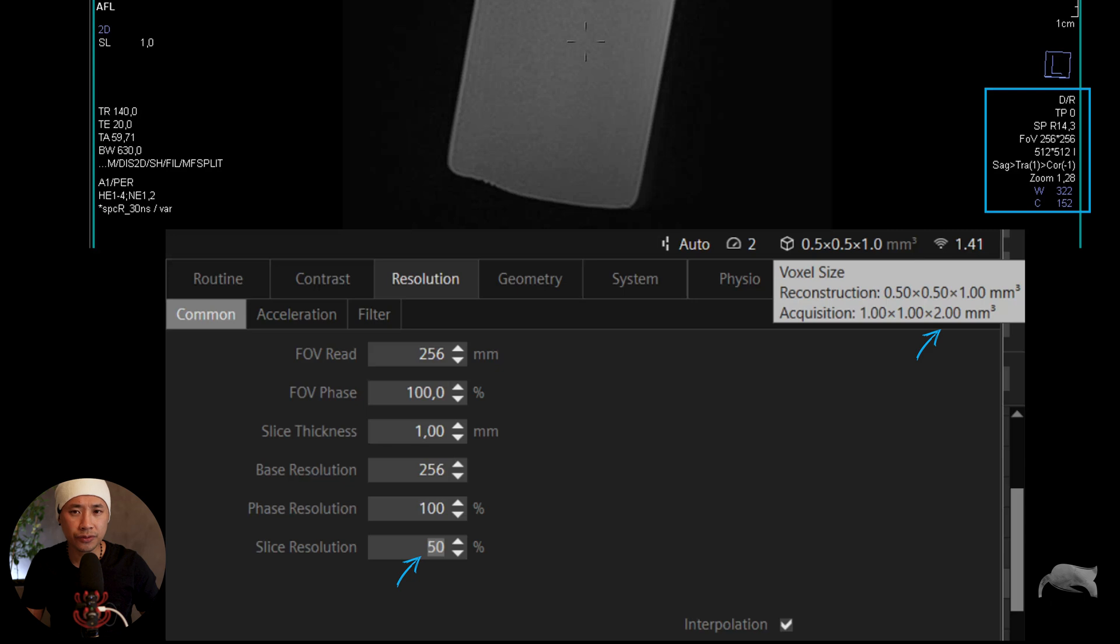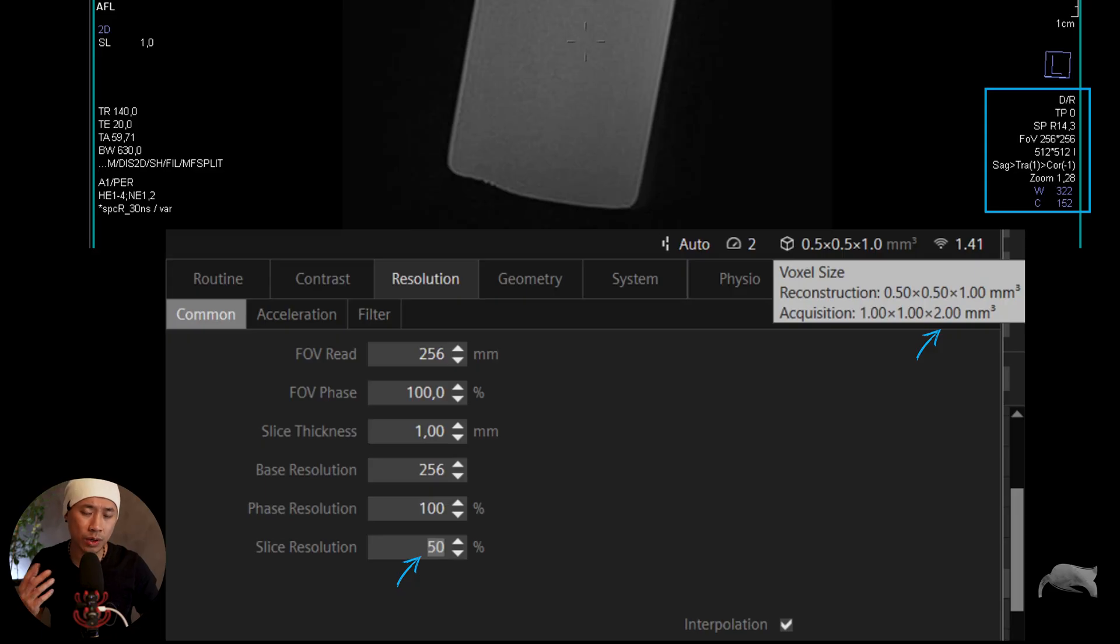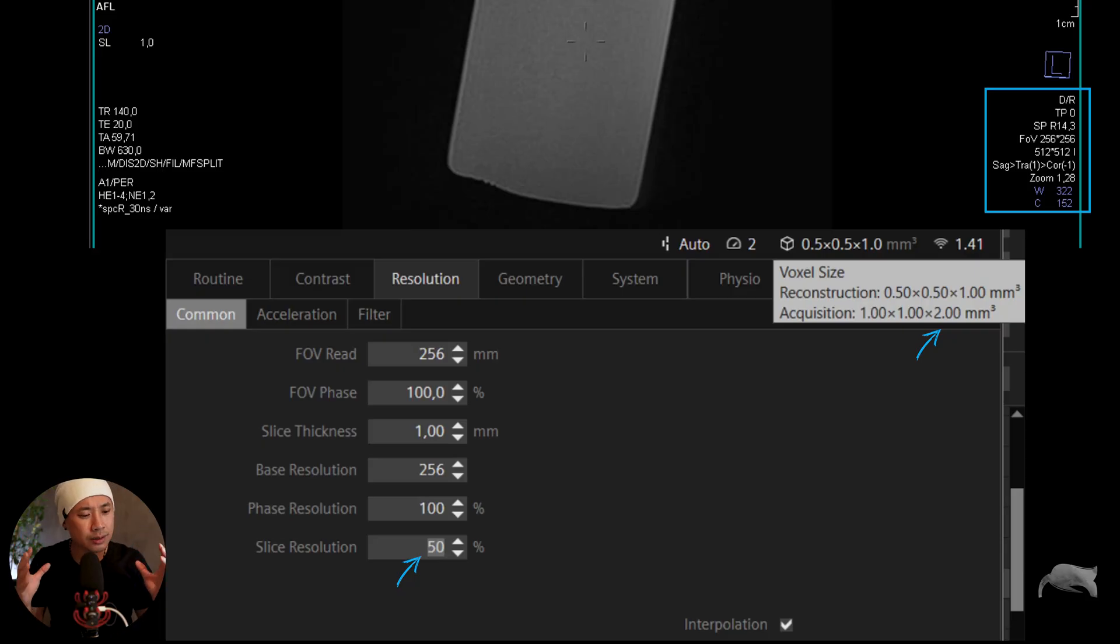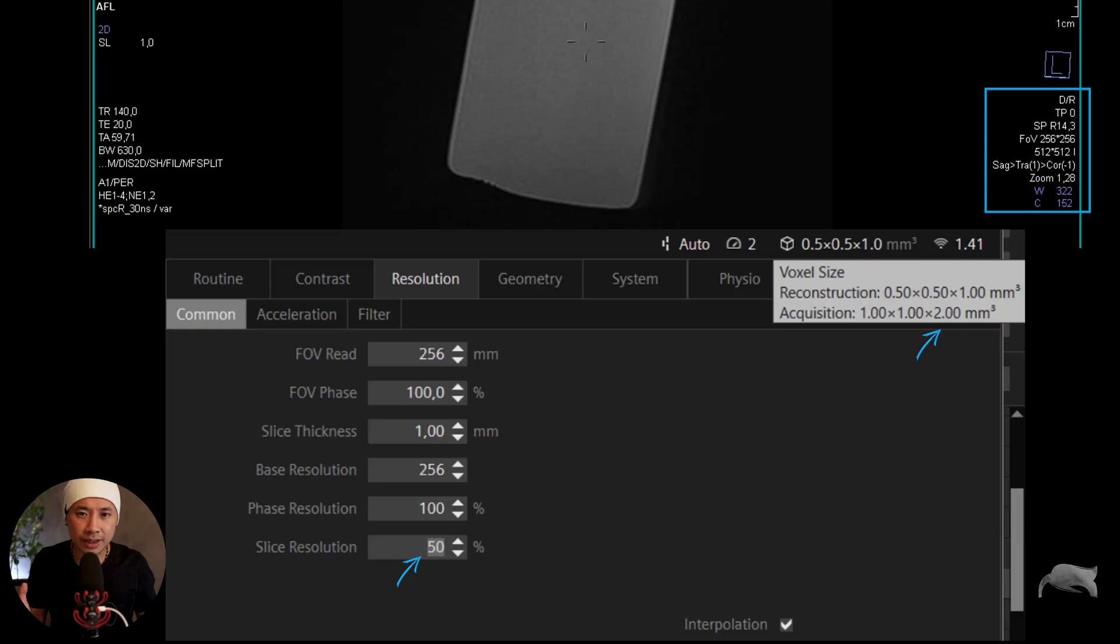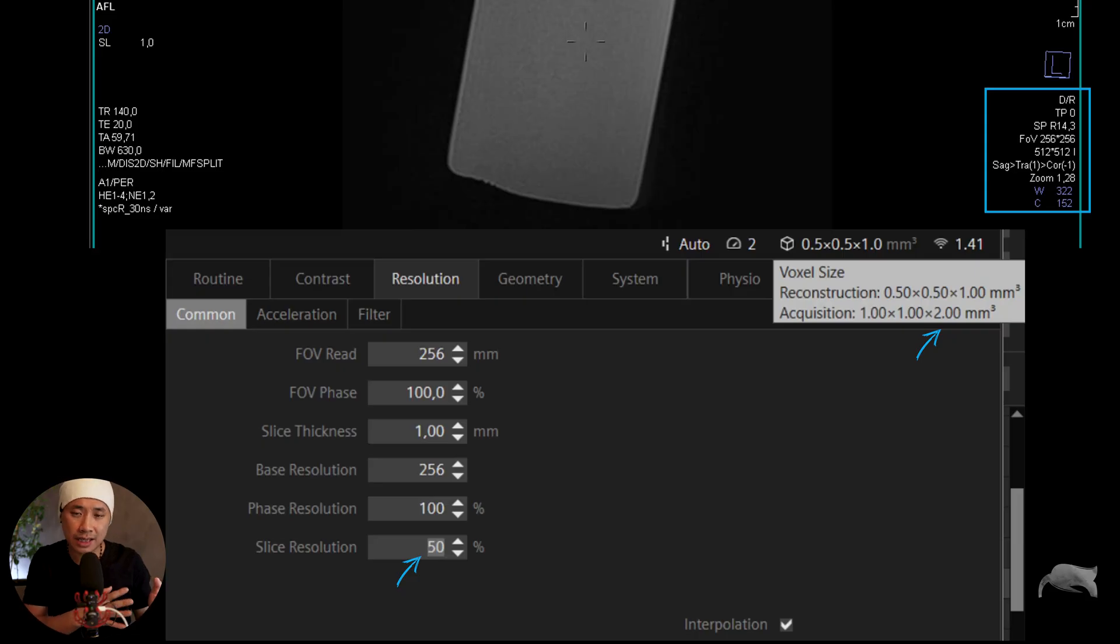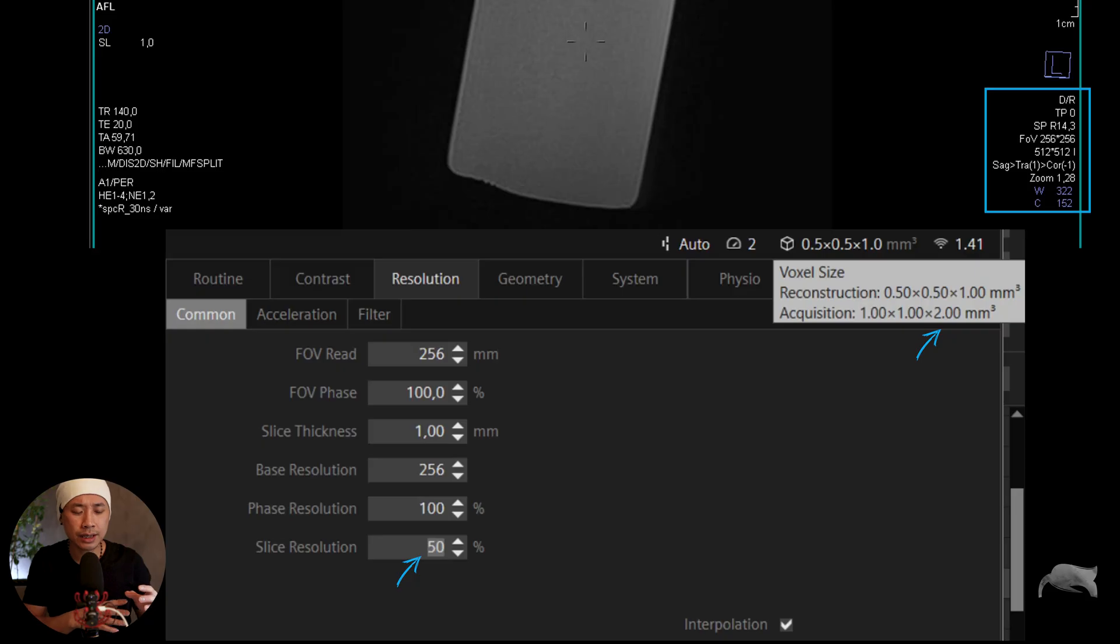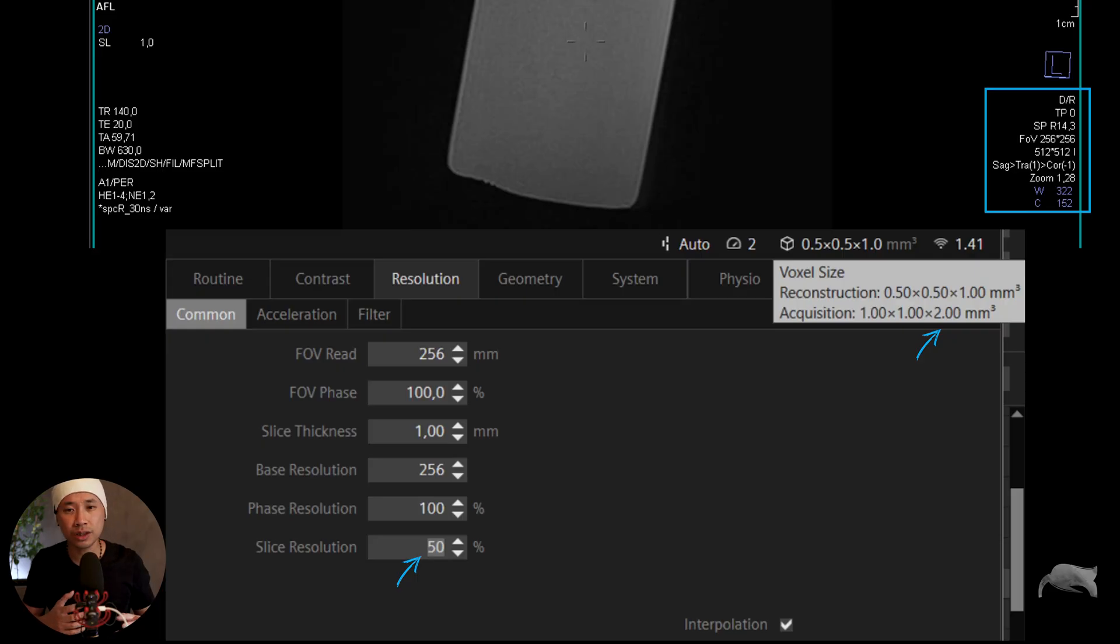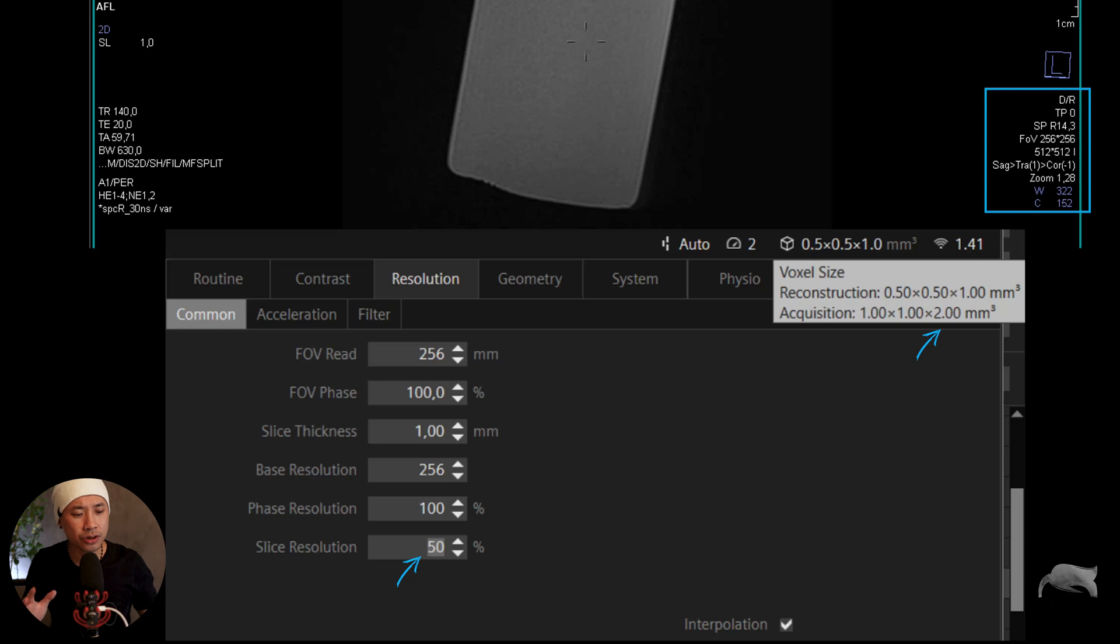But then on the slice resolution we are doing 50%, so that means you are now having an acquisition of two millimeter and then you reconstruct it down to one millimeter. It sounds strange, it sounds difficult, but you don't have to understand everything now. Just know that this is how it works, and if you want to have a further understanding, watch the other video. But it takes time to understand - it took time for me to understand this as well. I'm not expecting you to watch one time of this video and understand everything.